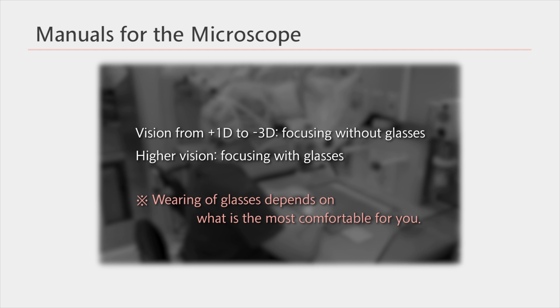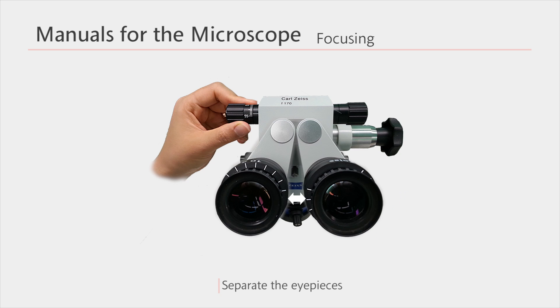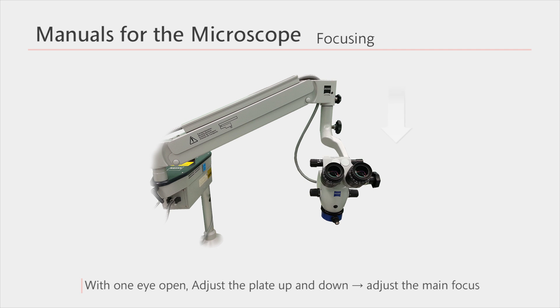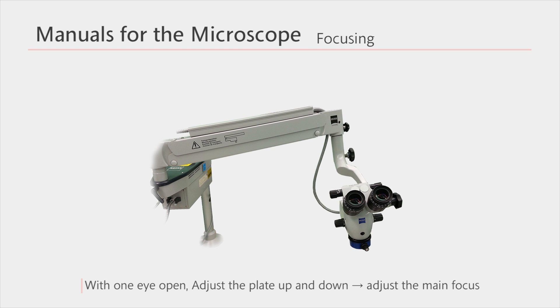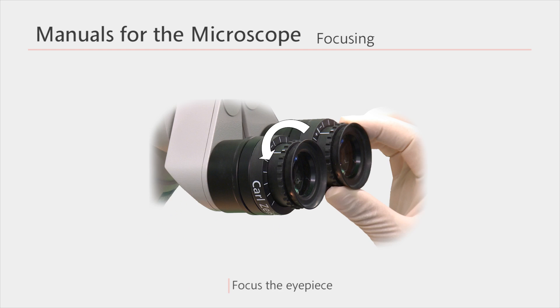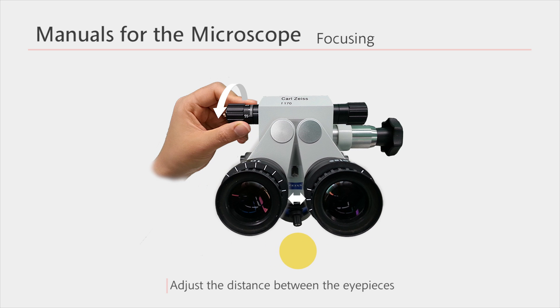However, it's best if you use what is the most comfortable for you. In summary: zero the focus of the eyepieces; separate the eyepieces; increase to the maximum magnification; place one eye on the eyepiece; adjust the main focus with the coarse focus knob; decrease to the minimum magnification; adjust the eyepiece focus; adjust the eyepiece focus of the other eye; decrease the distance between the eyepieces — and you're done with focusing.